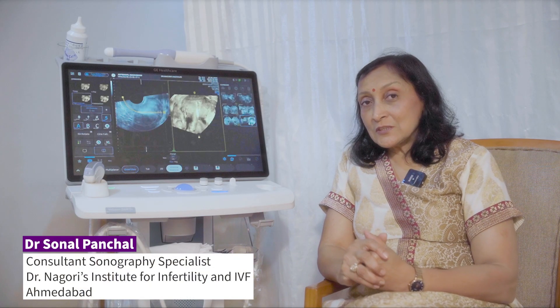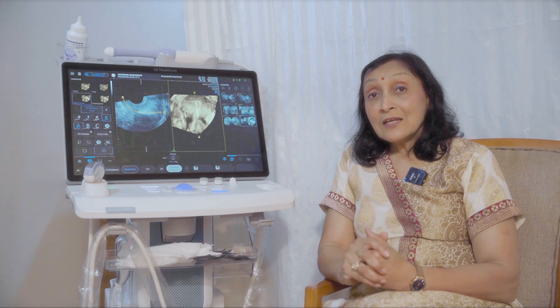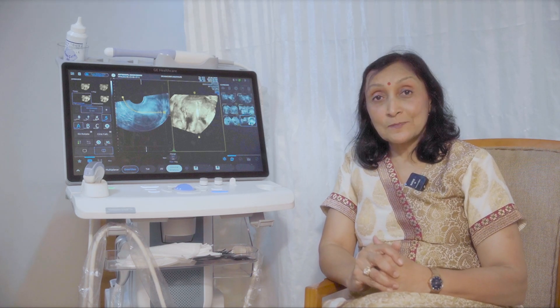I had a dream of a machine which can be easily cleaned, which can be easily shifted anywhere, and still has an excellent image quality. That came out with this new model of Voluson, which was the Voluson Swift.